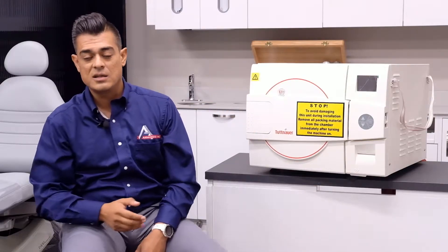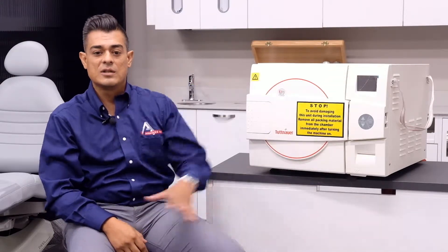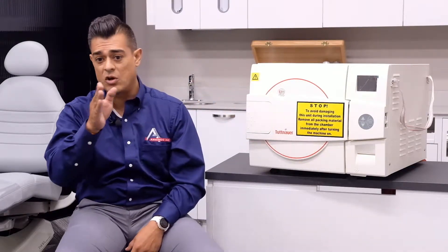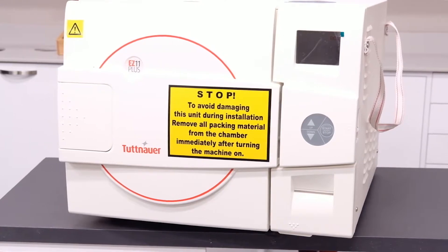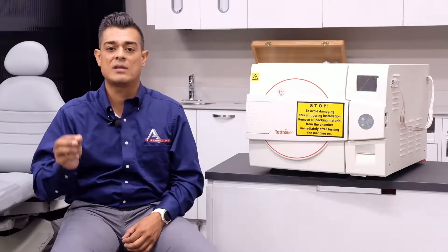Another thing that makes the EZ11 Plus really friendly to use is its Easy View display. It shows not only the actual temperature but the pressure in the chamber, and it also displays each stage of the cycle. As the color wheel moves, the stage also moves. Going back to that easily displayed interface — if you're a few feet away, you don't need to go right up to the machine. You can be a few steps away, look at the color wheel, recognize those colors, and know exactly where the cycle stage is, then keep going with your day.